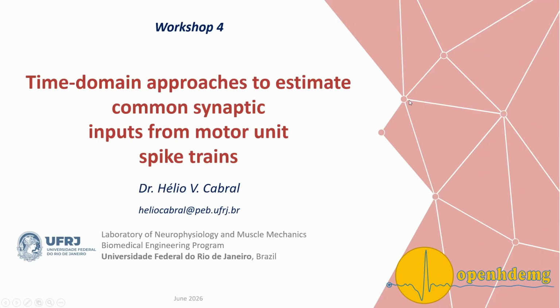Okay. So hi everyone. After the introduction of Francesco on the methods, a brief introduction on time domain and frequency domain methods, I believe that you were able to see with Giacomo's presentation how to use the tool. So in an integrated framework we can decompose, clean, and then the last part of our workshop is to cover the estimation itself of the common inputs.